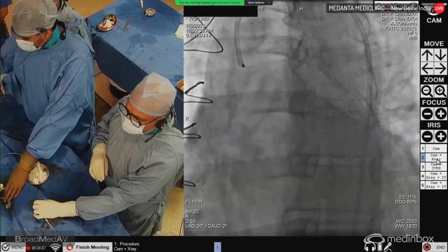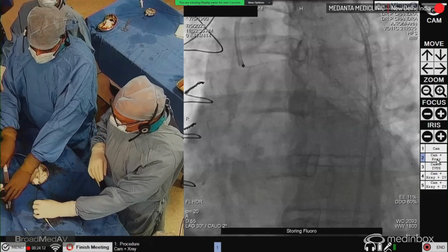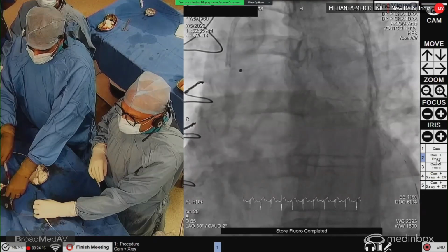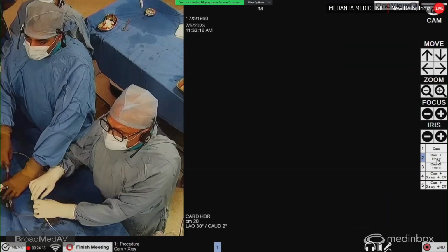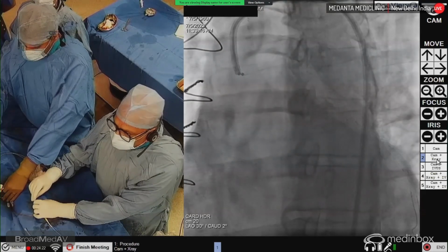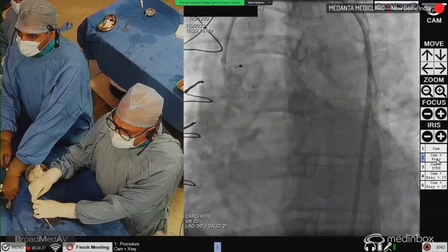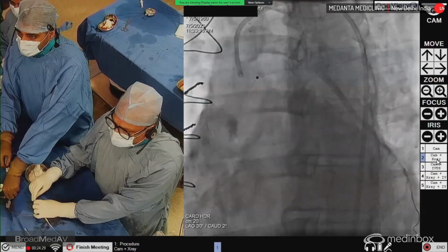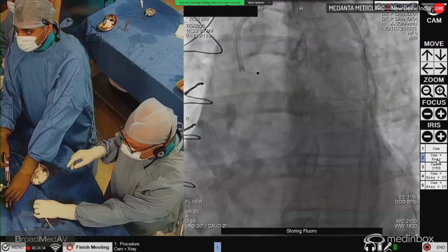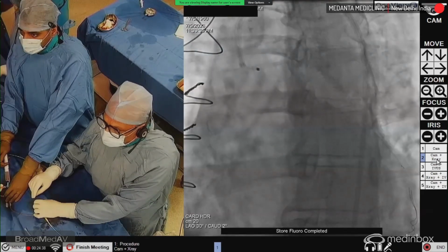Okay, fine. Now you can check. It's always better to check in between. Let's check it. Yeah, looks better. There is no incidence of slow flow here. We are still fine. So now you can store it, please. Store these images and flushing on. Yeah, flushing on.